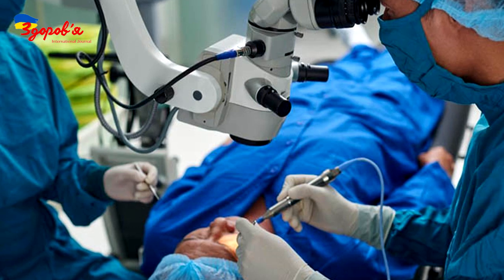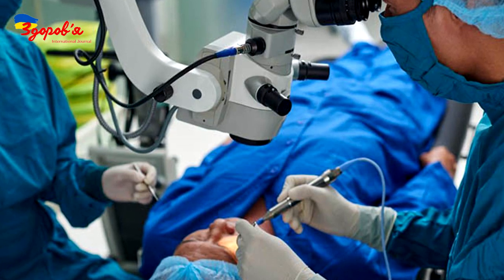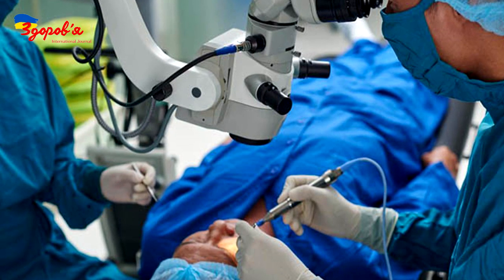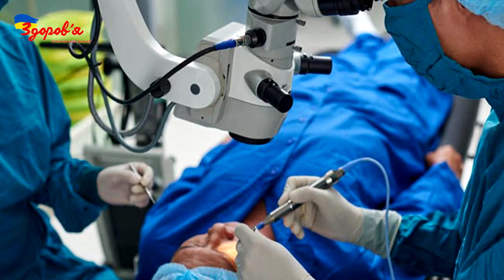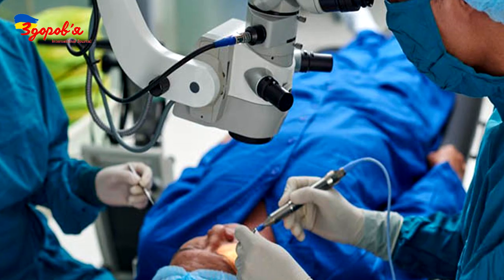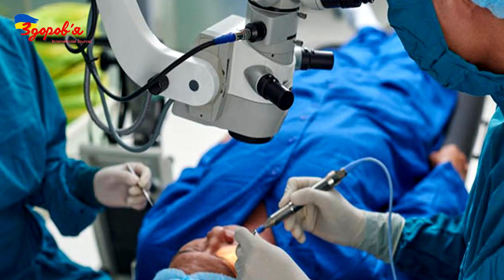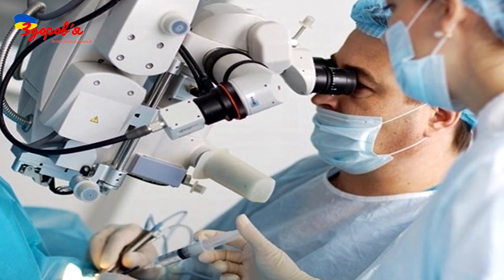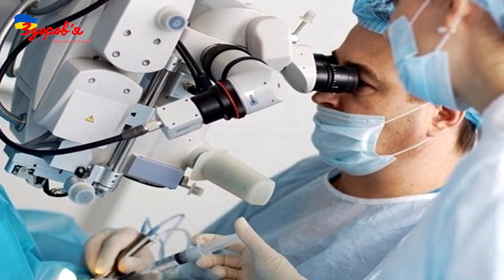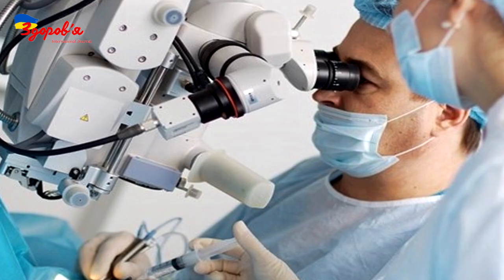The need for a combined operation to remove the vitreous body, natural lens, and further implantation of an intraocular lens is connected with the presence of several pathologies in the patient at once. In the course of phacovitrectomy, it becomes possible to simultaneously remove the cataract and the vitreous body within the framework of one surgical intervention.